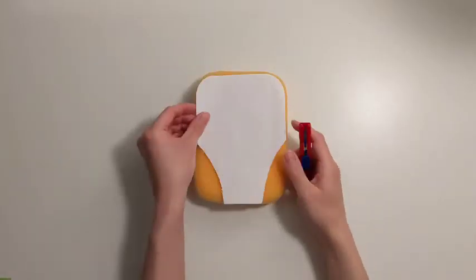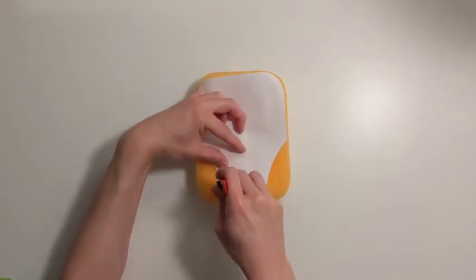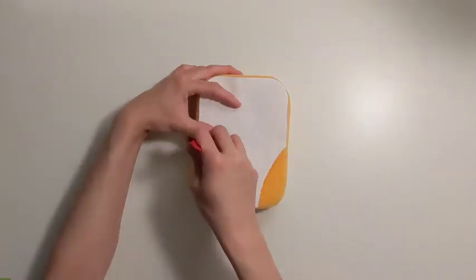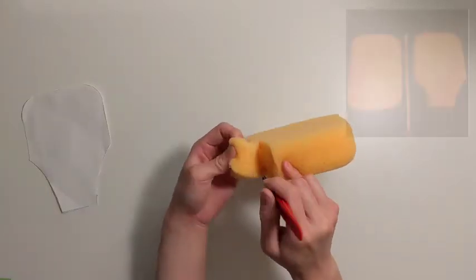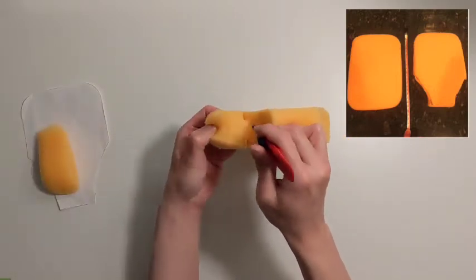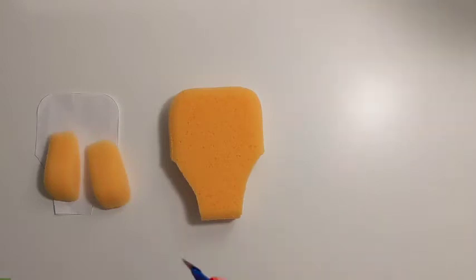We will start by creating the uterus out of the large orange sponge. Using a stencil, trim two corners of the sponge. A knife is usually easier for this step, although large scissors will work as well. With a knife, poke along the edges of the stencil on both sides. Then peel away at the edge that will be removed and cut the remaining sponge away.